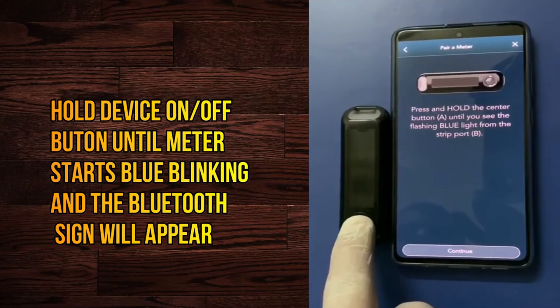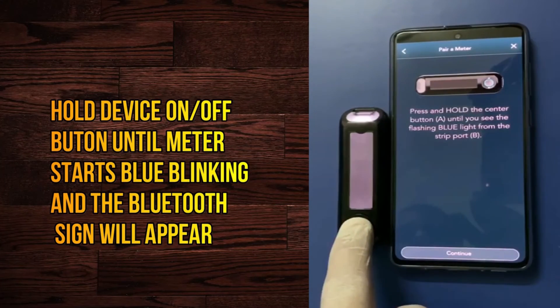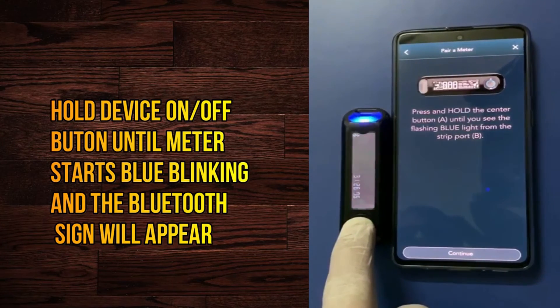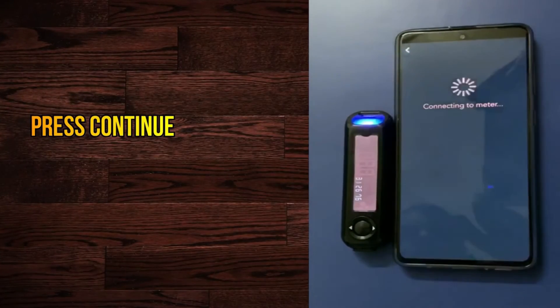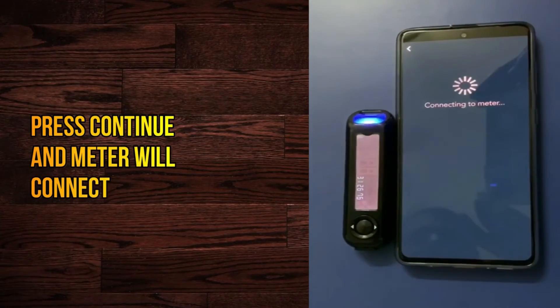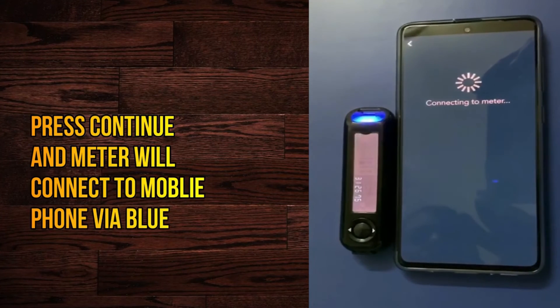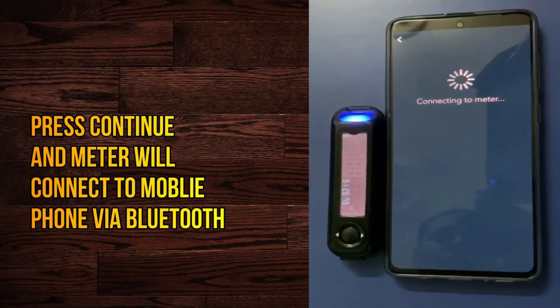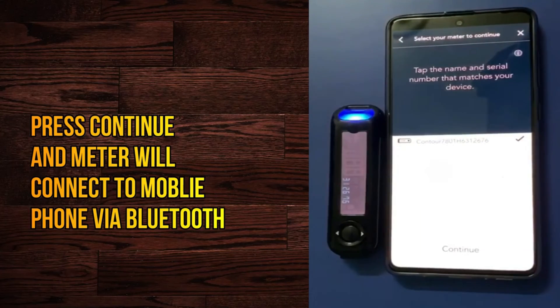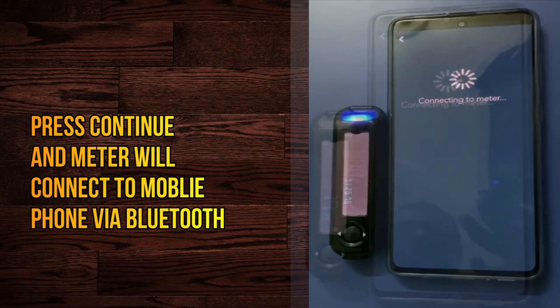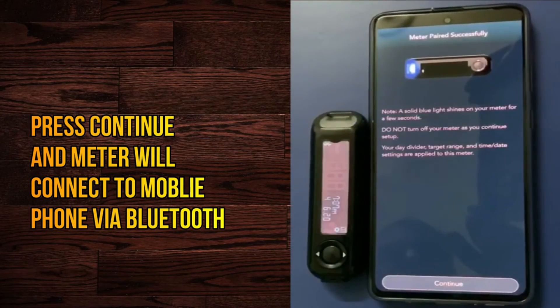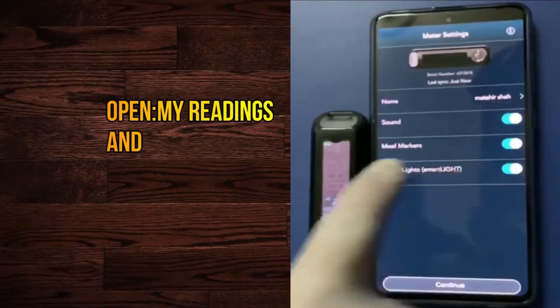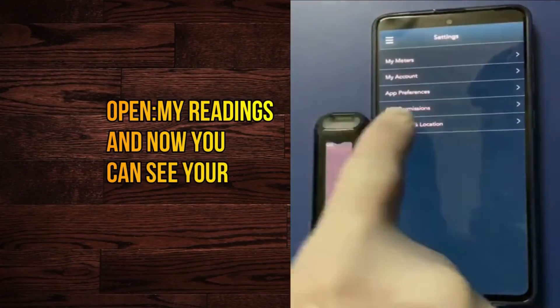You can see here — by clicking this button, now press Continue. This will take a few minutes. You can see here the meter is now connected to the mobile. Here you can see your results.